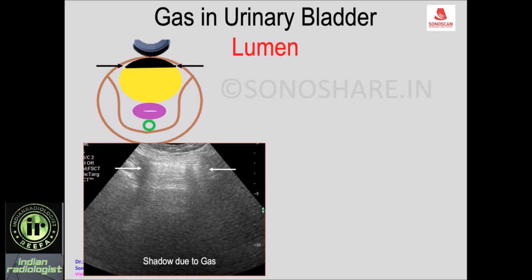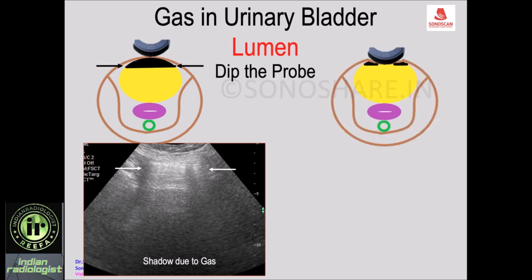This is the appearance. To confirm that there is gas within the lumen of the urinary bladder and not in the bowels or in the wall, a useful, simple technique is just to dip the probe down. When you dip the probe, the gas in the anterior part of the urinary bladder will be separated into two.